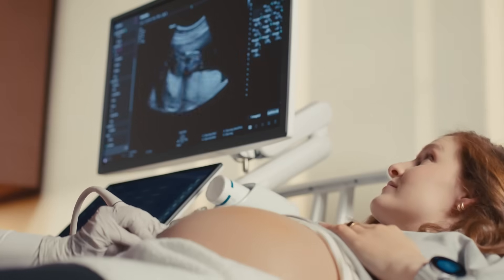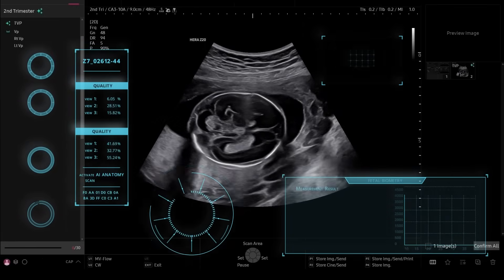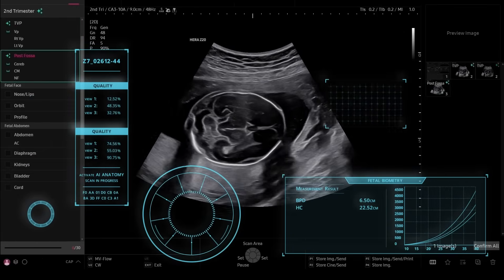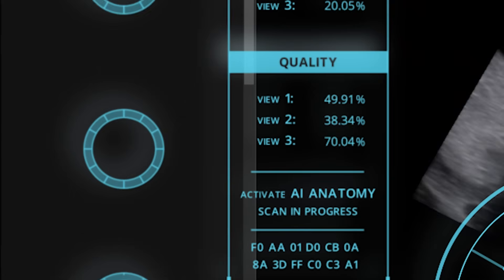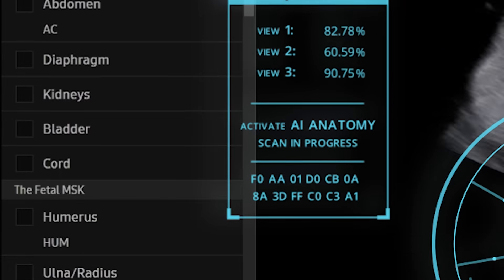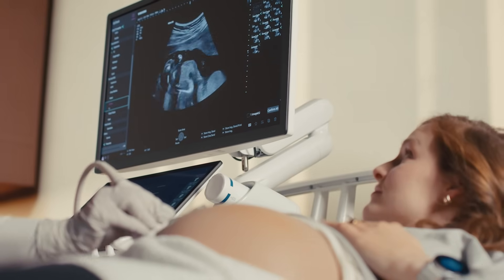When it comes to ultrasound, capturing the perfect image isn't always that easy. Until now. Introducing Samsung Z20 with Live View Assist — a real-time AI-powered tool that simplifies exams by automatically identifying and capturing required views during live scanning, with no user interaction.